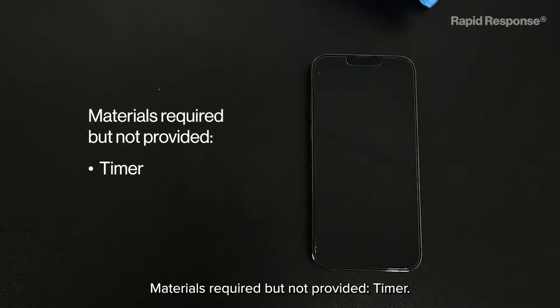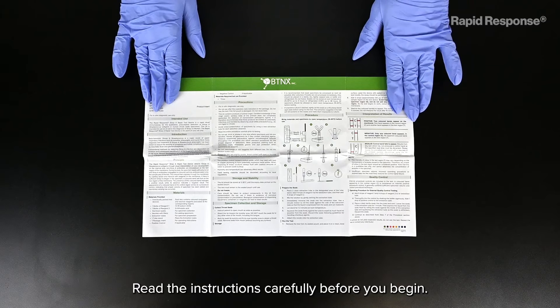Materials required but not provided: a timer. Read the instructions carefully before you begin.